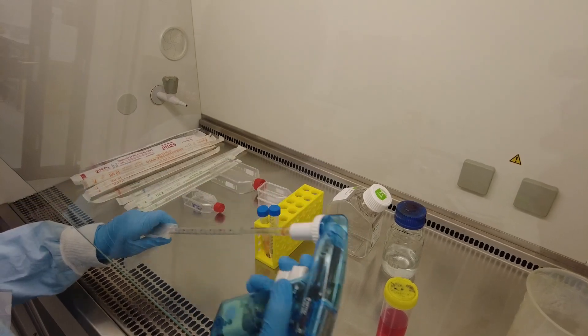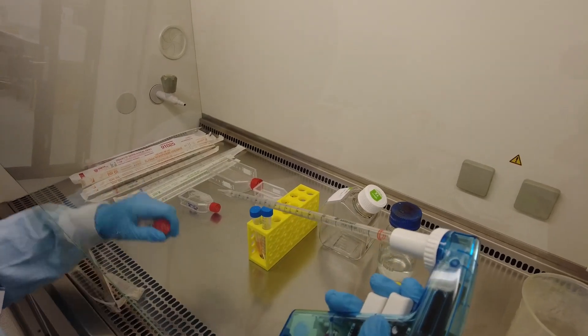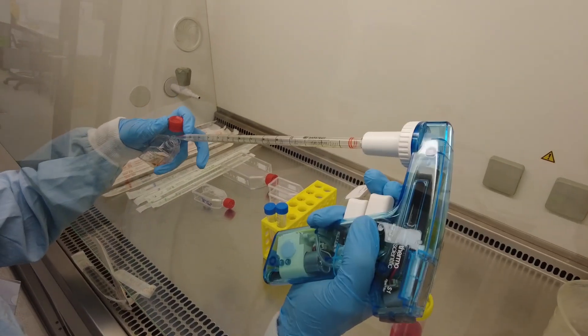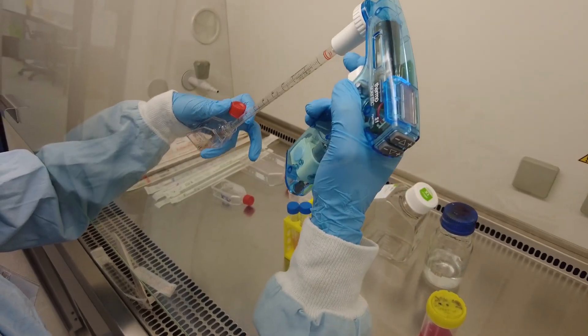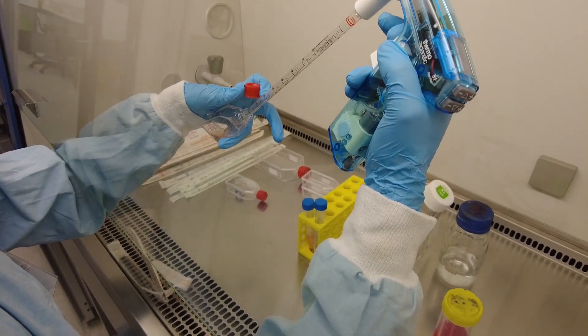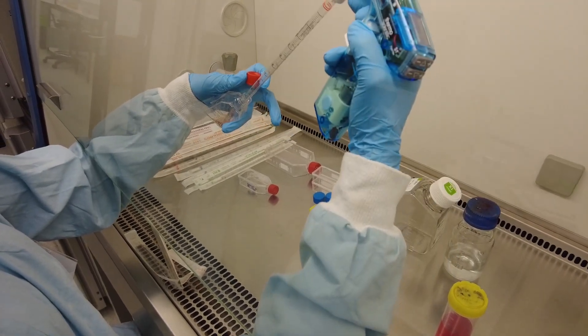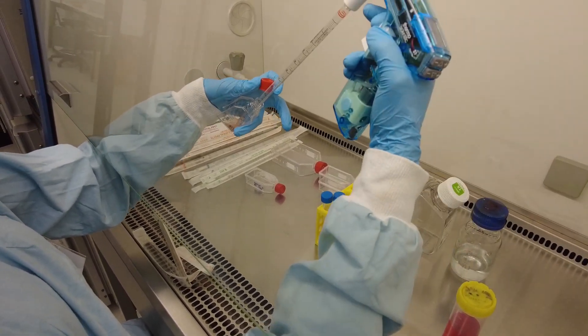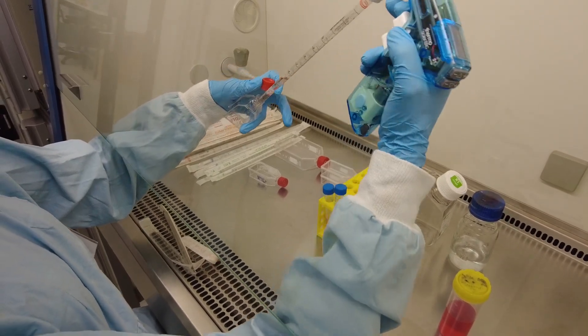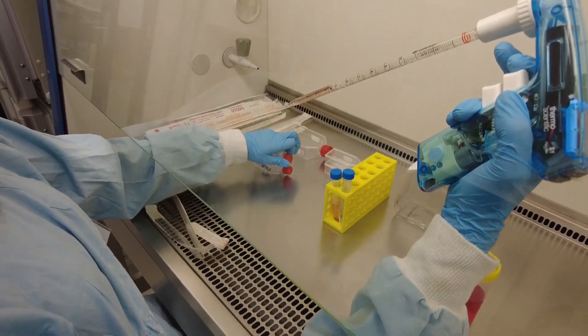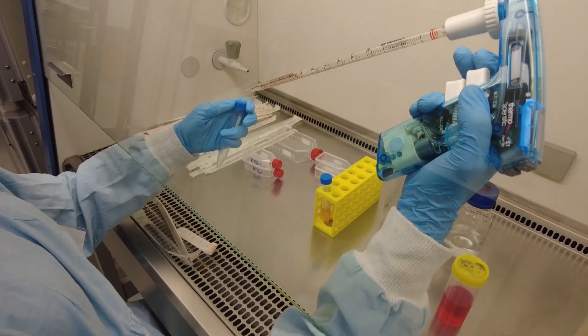Same thing for the second one. We're just pipetting everything washing the bottom of the flask in case any cells are left over. Then we're taking up all the liquid into another centrifuge tube.